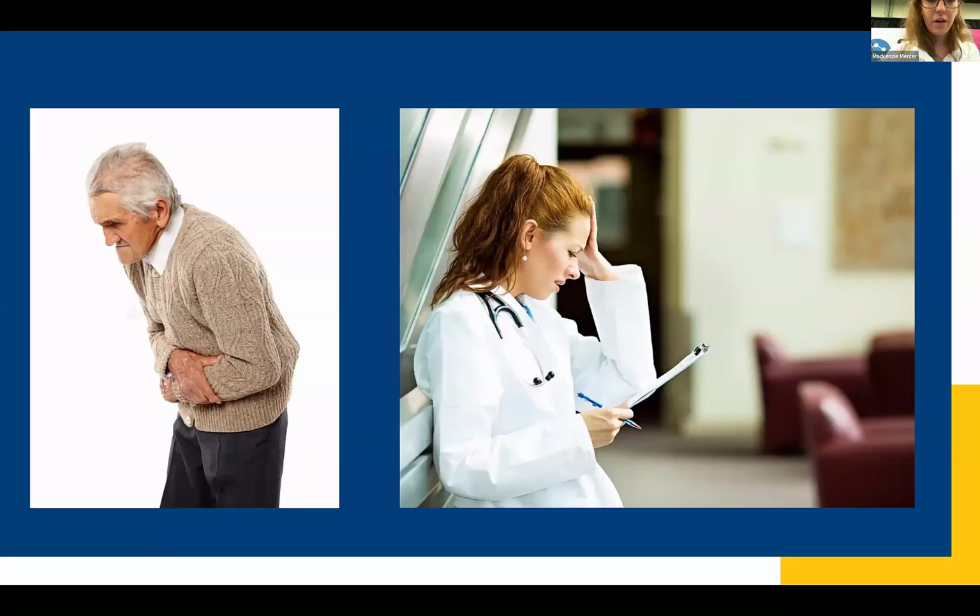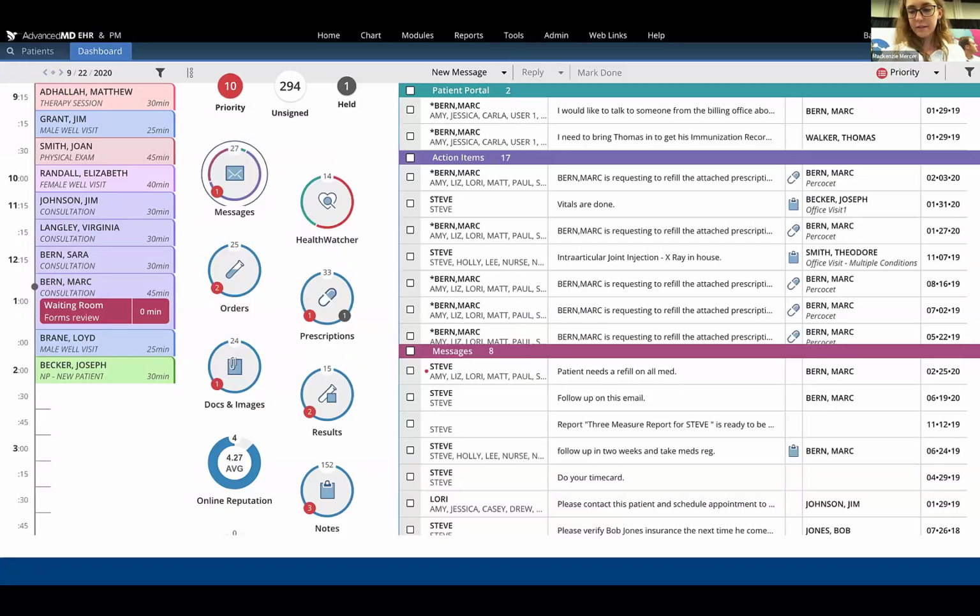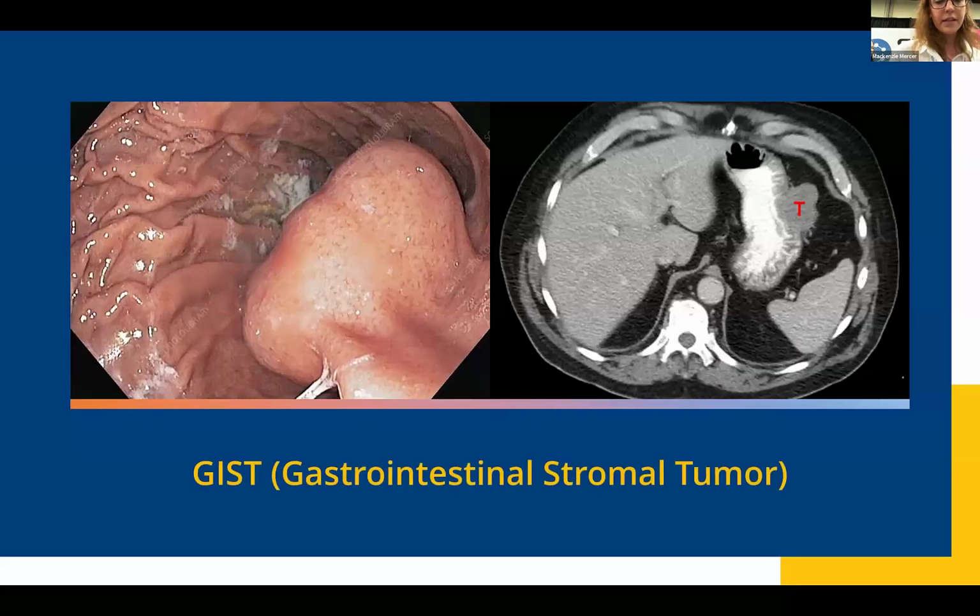Our clinical case involved a white male at 73 named Gene Sim, who's experiencing abdominal pain and discomfort. His primary care physician, Dr. True, unsure of what to do next, ordered a CT scan. Upcoming his next appointment, she navigated to his electronic healthcare records to view the radiology report. Here she saw that a mass was present in his stomach that was suggestive but not definitive. She suspected a GIST but was unsure, so she had a few options.